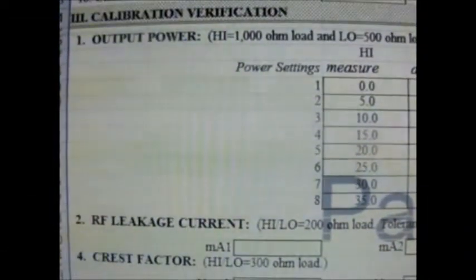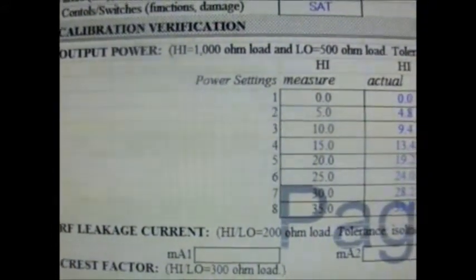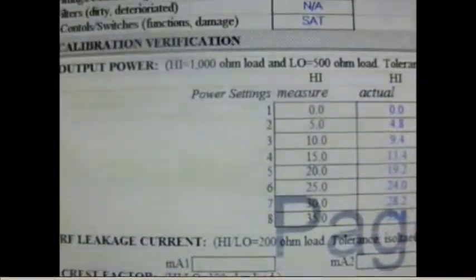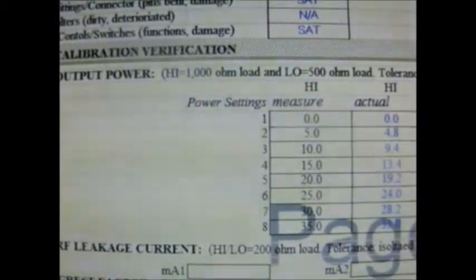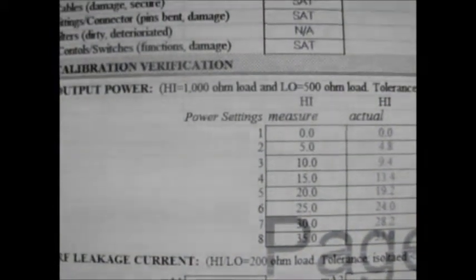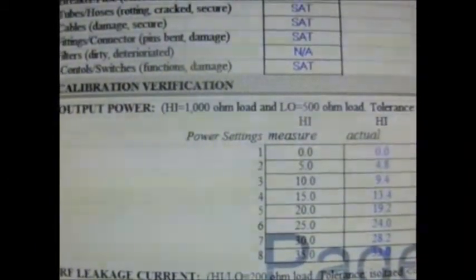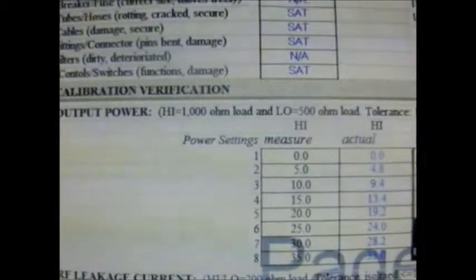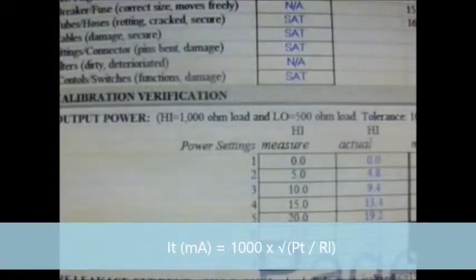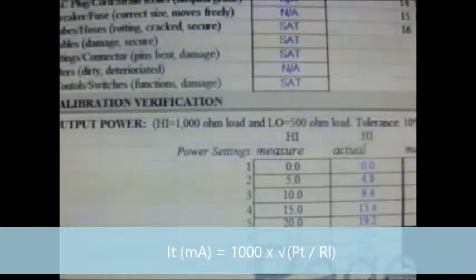The first test is the output power test. The power output is the output of the current density, or the power, to the skin side through a 500-ohm test load. You can consult your OEM service manual for specific ohm values for your device. In our case, a 500-ohm test load simulates body impedance or AC resistance on the low side. The formula is: total current measured in mA equals 1,000 times the square root of the total power divided by the resistor load.